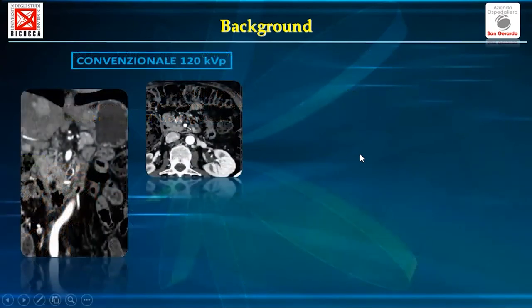And let me show a typical example from our everyday clinical practice. This was a patient with several hypervascular liver metastases. And with our CT scan, we should find out which could be the possible cause. And we are looking also at two specific images.